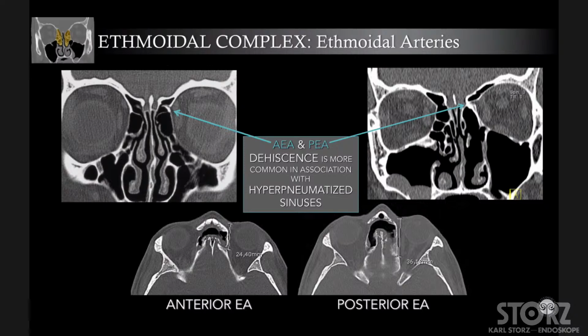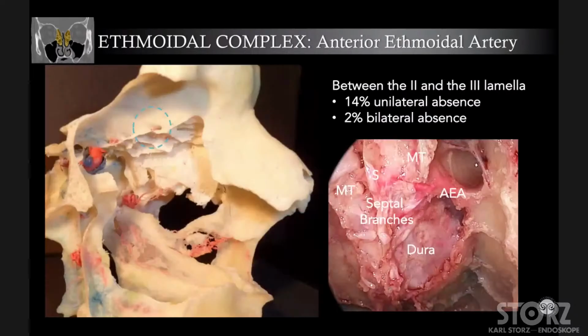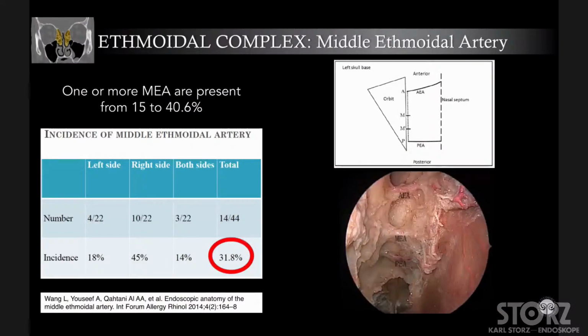So you have to be ready and able to understand these things on pre-operative CT scan in order to anticipate such a condition.